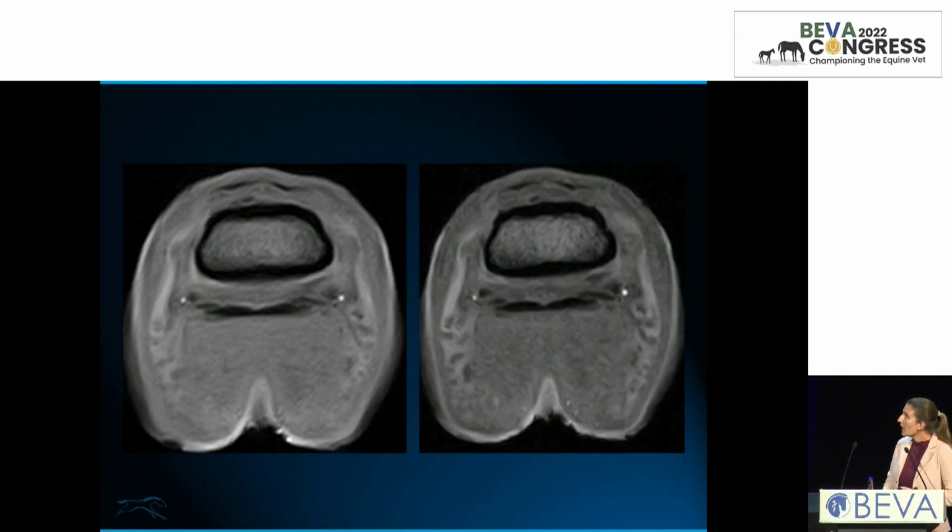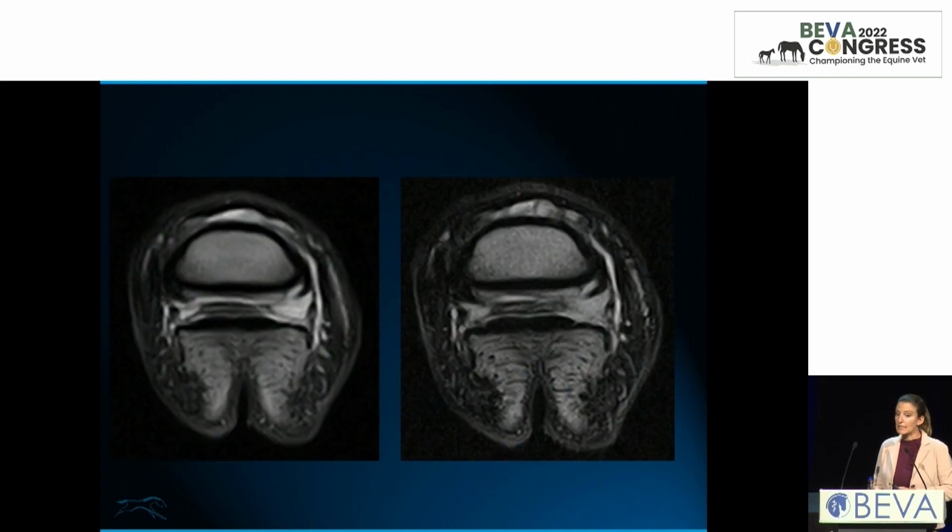Here I just want to show quickly the comparison between a T1 3D on a low field system with a 3 mm slice thickness versus a T1 3D high res with 1.5 mm. And you can see quite clearly, even on the big screen here, that we have a very fluffy situation on the left side. There are some enthesiophytes which may well get smoothed over, and the definition of borders of soft tissues may become blurry. So we are losing detail.